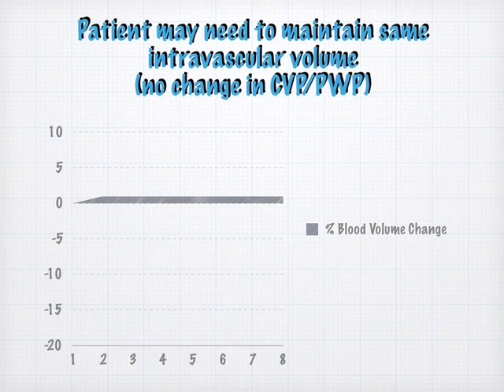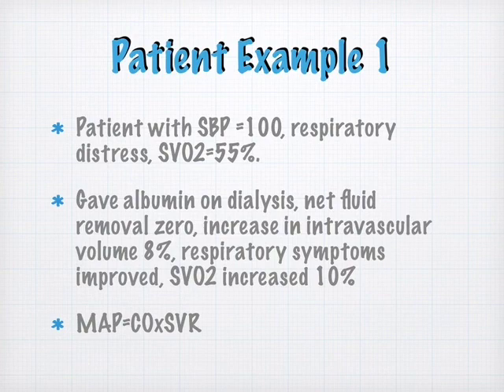Knowing that I don't trust gadgets implicitly, I always would correlate this with patient conditions, and if you had SVO2, then you could see whether what we were doing was affecting the SVO2, which is just a very good indicator of the impact that we're having on oxygen delivery and consumption. So I just want to go through some patient examples real quick here. I just have 3 of them.